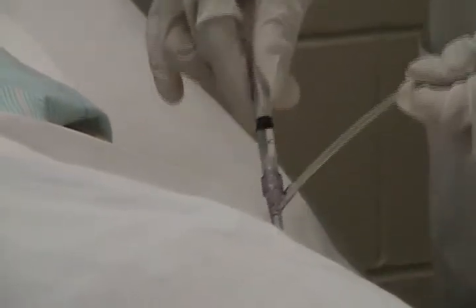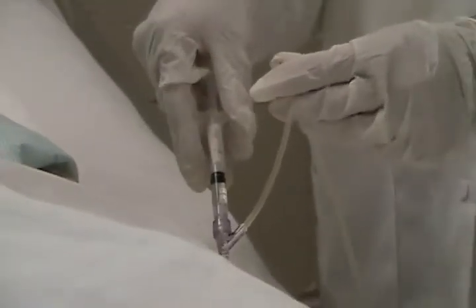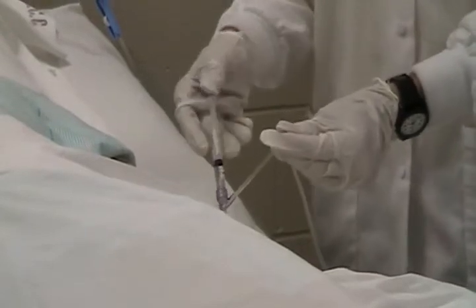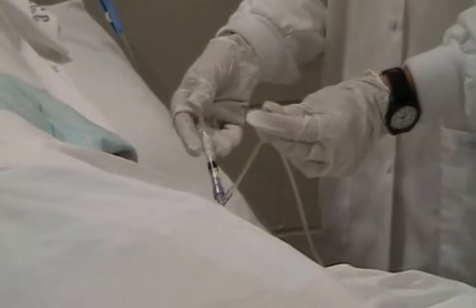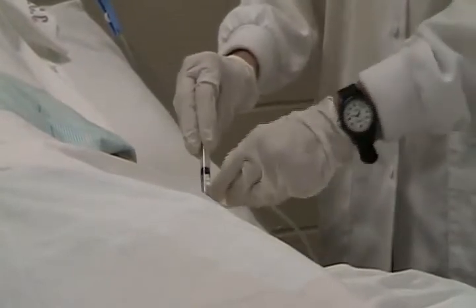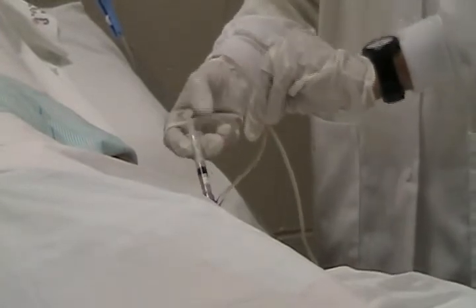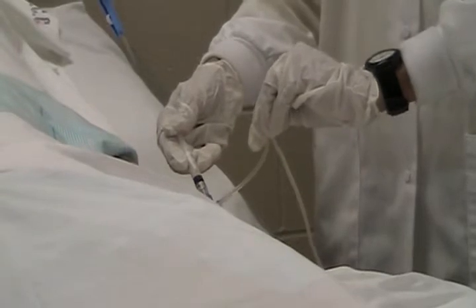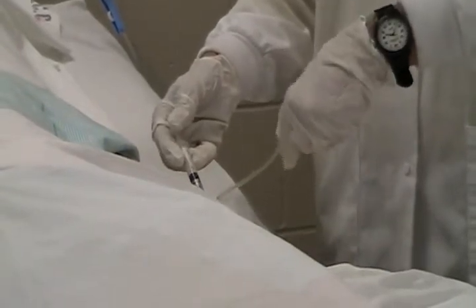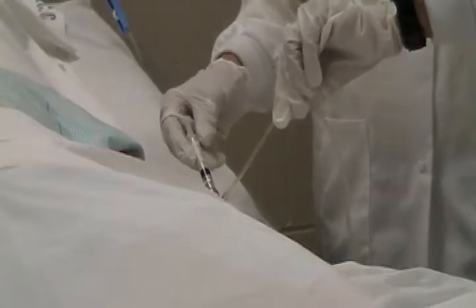In order to administer the medication, I'm going to be pinching the IV tubing to allow the medication to freely run directly into the patient's IV without backflowing into the tubing. I've pinched the tubing, and now I'm going to administer 0.3 mLs of the medication while I'm noting the time on my watch. Once I've administered the medication, I can release the tubing and wait for the remaining 15 seconds.